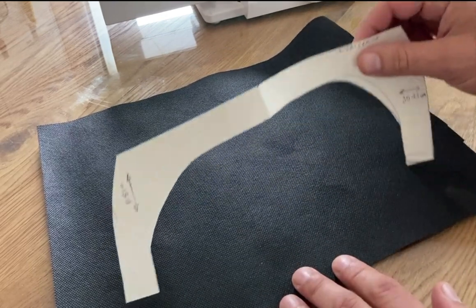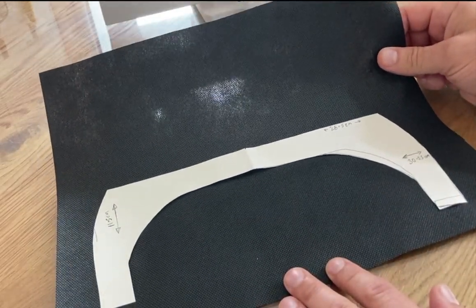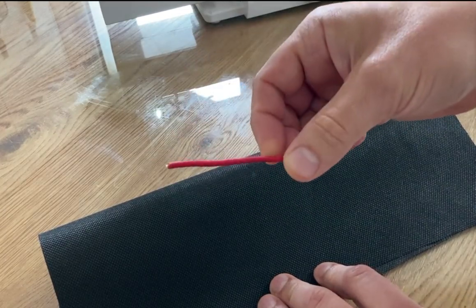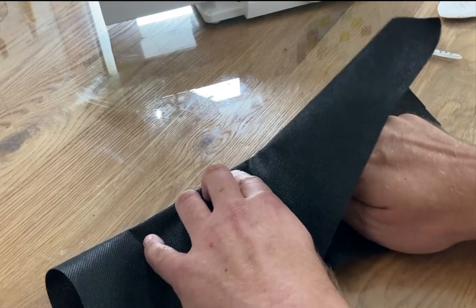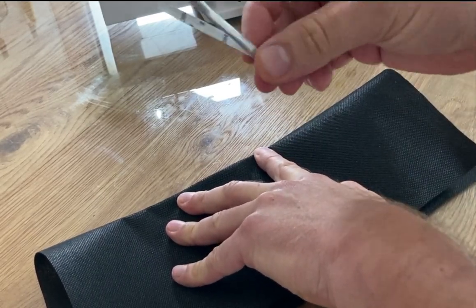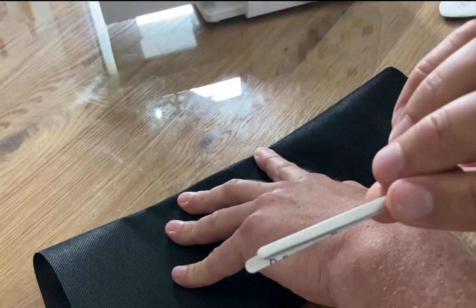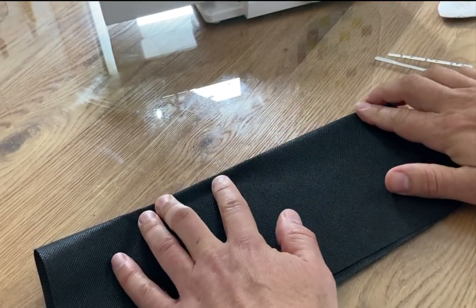So first of all, I have a template, a piece of spunbond polypropylene about twice the size. First piece is easy. I'm going to take a piece of wire. This one is upcycled mains flex from a recent rewiring of the house. I've got it in there, just there and in between, but I could easily take some classic aluminium nose wire pieces. In this case, these ones are adhesive, and I would stick two together to make them thicker so it would last months rather than a week.